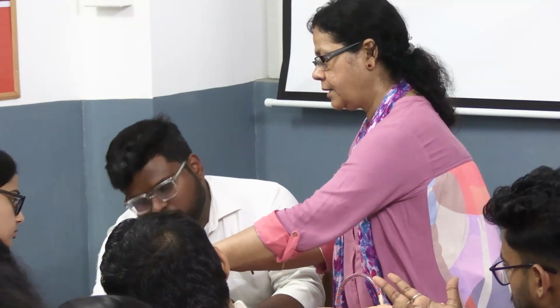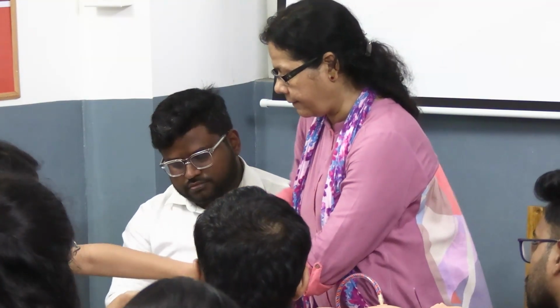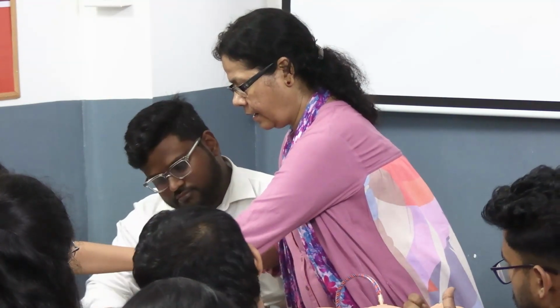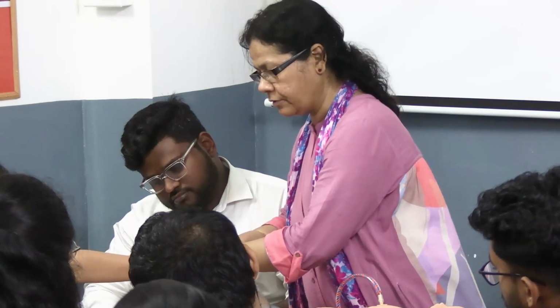Hold it like this, between these two fingers, see? And hold. The other hand will be here, pushing it back, and this will be retraction. You feel the traction. This is the counter traction.